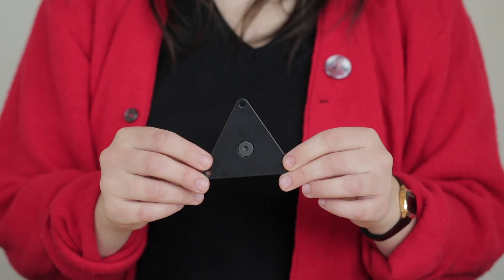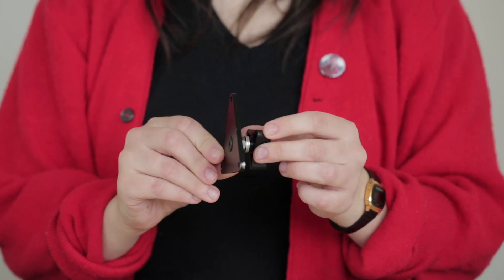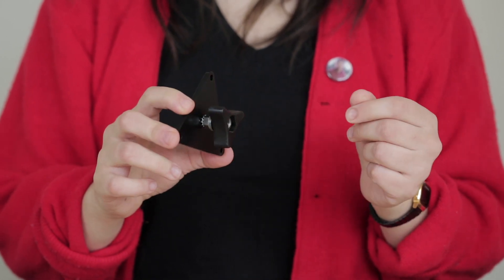To mount a controller, joystick, or accessibility switch you will need an appropriate and compatible mounting plate. We use this triangular plate as it fits both the controllers and switches we use.